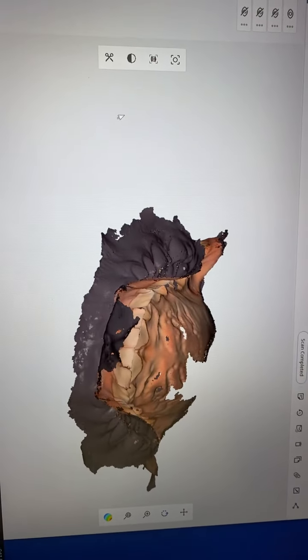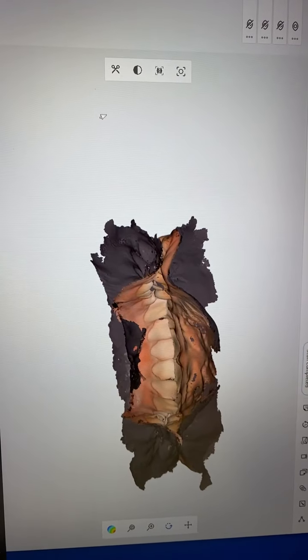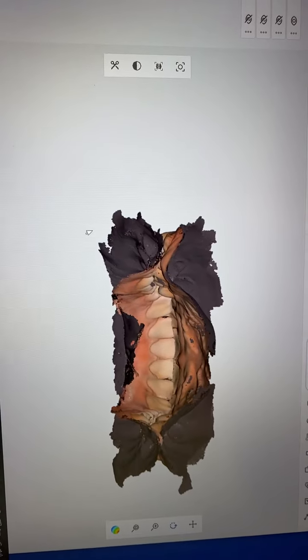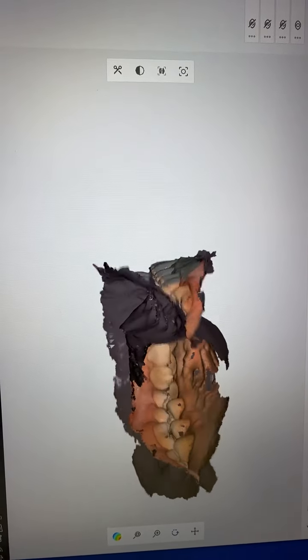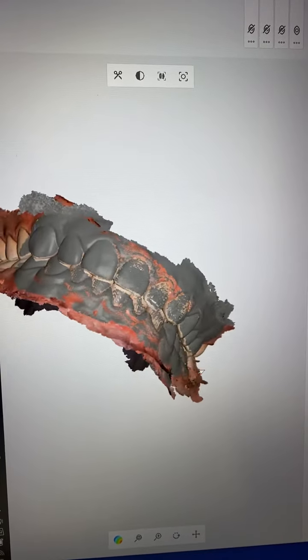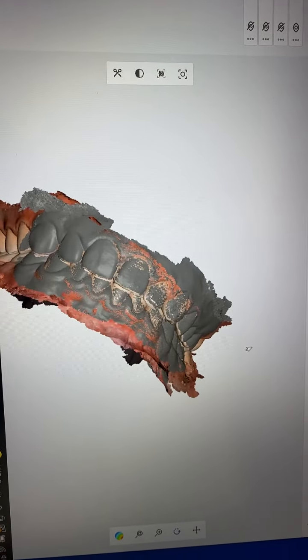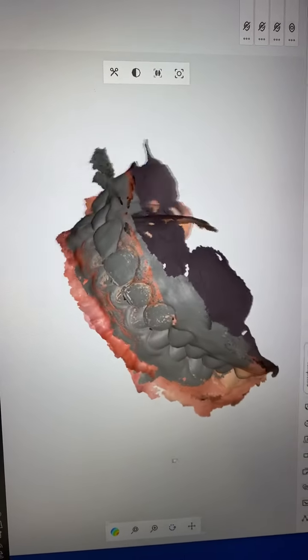So that's how you show the patient using Medit500. See the deep bite? The patient has a very severe deep bite. If you look from her tongue view, it's completely deep bite, almost like 80% deep bite. That's the reason why. So when you close the gap, the deep bite improves another 30-40%, and you're going to have a great chance of reducing the grinding problem for the patient.